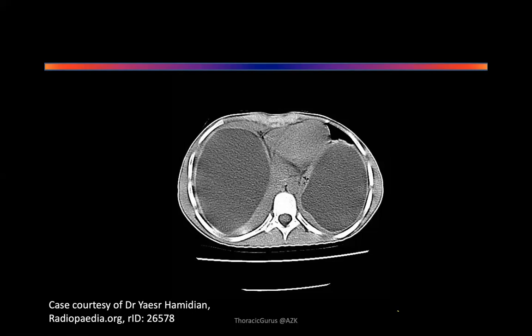This is an unidentified mediastinal window of a chest CT scan showing bilateral homogeneous well-defined cystic lesions. Okay. Differential diagnosis. Bilateral bronchogenic cyst. Okay. Not common, but okay. What else? Bilateral hydatid cyst, unlikely. No, why unlikely?